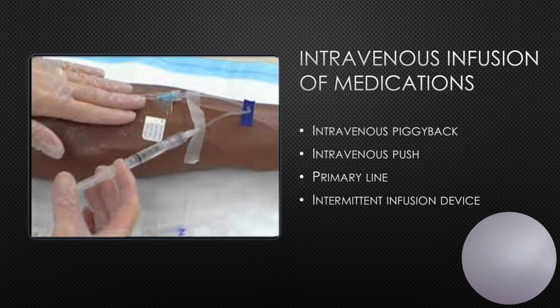If we're administering more than one medication, we will always flush with normal saline between the medications, and we will cleanse the port prior to each syringe attachment. So if we have a continuous infusion going, we stop the infusion and/or clamp the tubing just above the port closest to the client. And I recommend doing this even if you have stopped the infusion. Keep that tubing clamped during medication administration to prevent backflow of the medication up the tubing instead of down to the client.